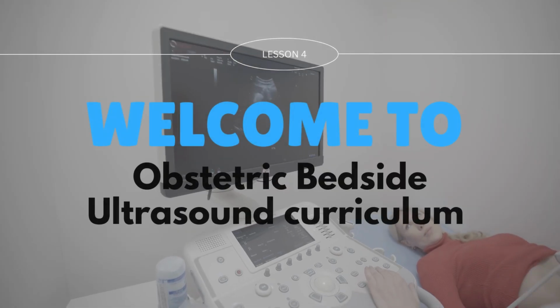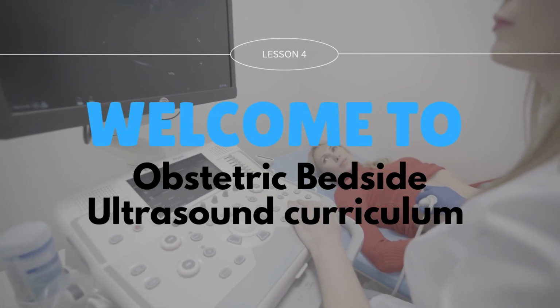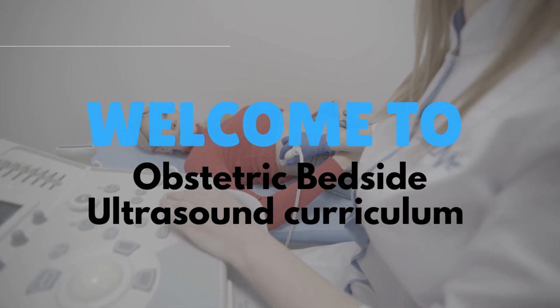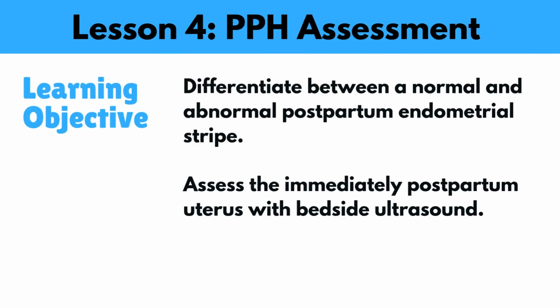Welcome to our Obstetric Bedside Ultrasound curriculum. Let's review a collection of online educational videos about assessing the postpartum uterus with bedside ultrasound. Our learning objective is to differentiate between a normal and abnormal postpartum endometrial stripe using bedside ultrasound.